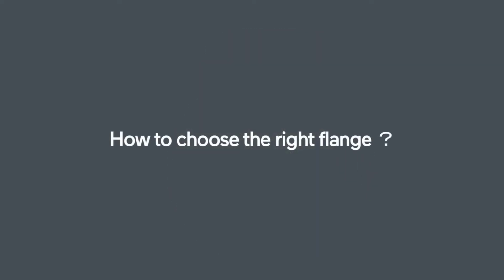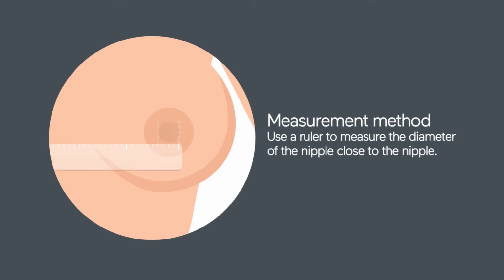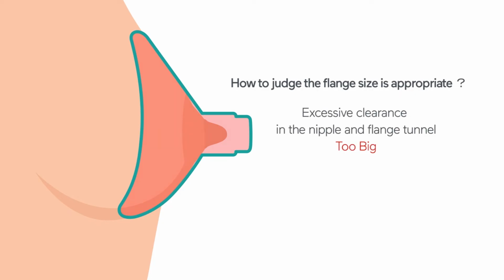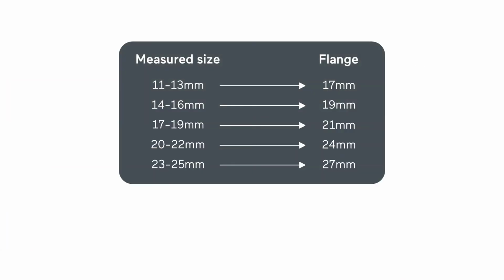How to choose the right flange. Measure the diameter with a ruler close to the nipple, and select the corresponding flange size according to the measured size. The correct flange size makes you comfortable to wear and helps mothers improve breast pumping efficiency.